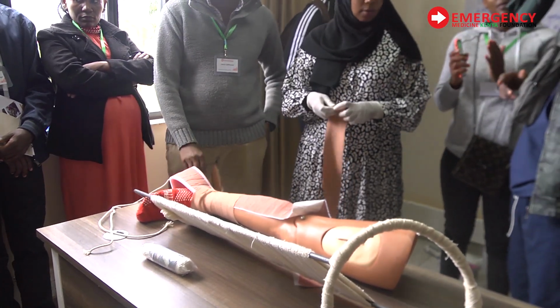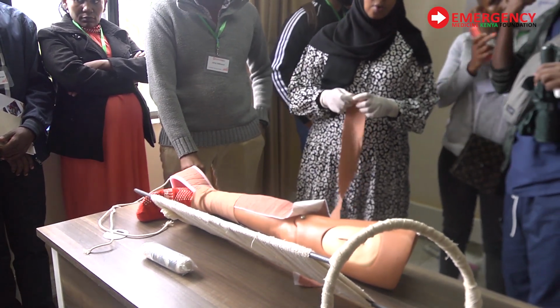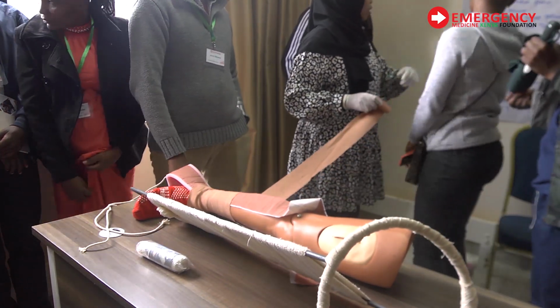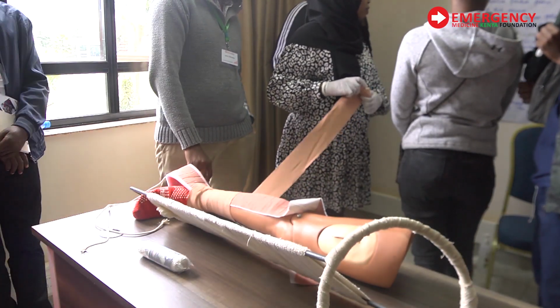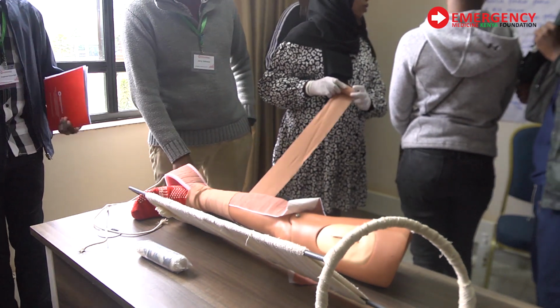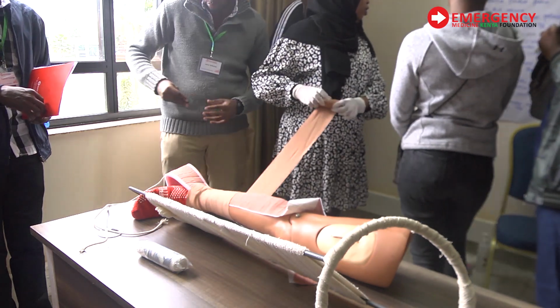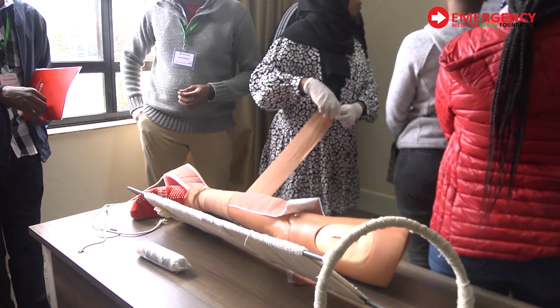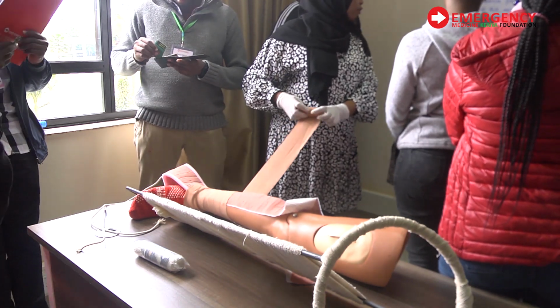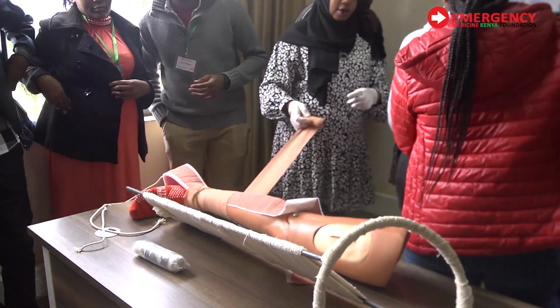We have a question about how you measure the ring size. I've even summarized for you guys here. You measure the oblique surface, circumference of the thigh immediately below the gluteal fold of the buttocks and the ischial tuberosity. Measurement should correspond with the internal circumference of the Thomas splint. Then measure the distance from the groin to the heel, add 15 to 20 to allow plantar flexion. So this one is the length now.